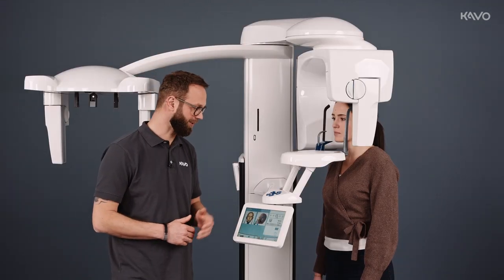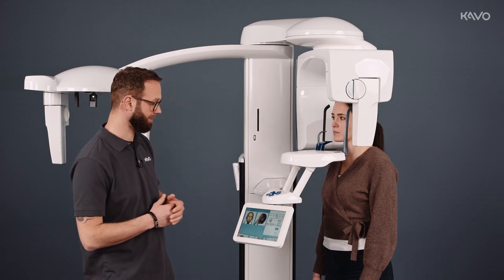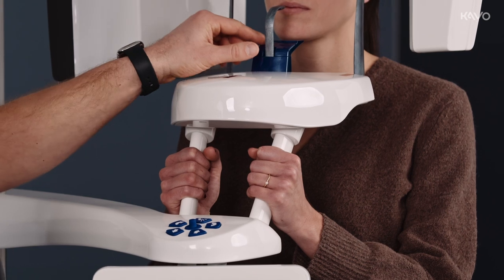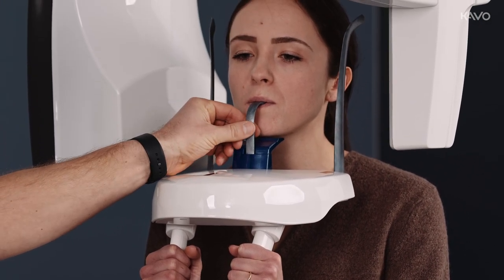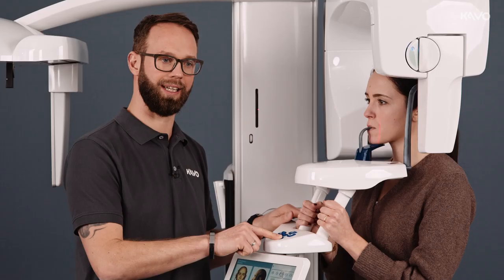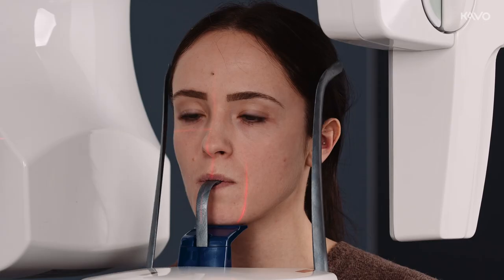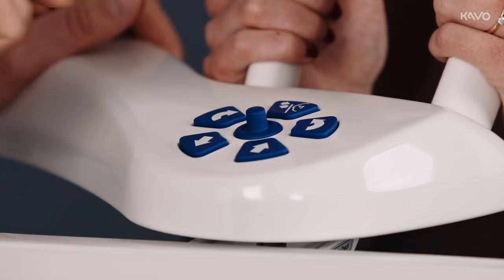In the positioning level, we let the patient enter the unit. They position themselves securely with their chin on the chin tray in the bite block and bite into the grooves. This shows the up and down movement of the unit. Here are the motorized temple supports and the option for switching the laser aimers on and off.